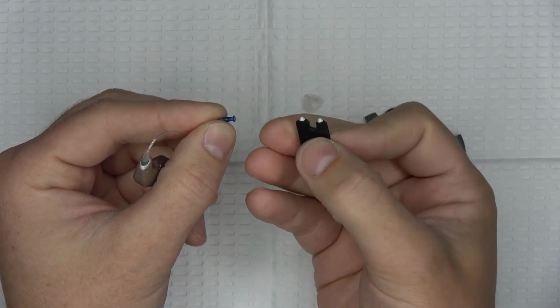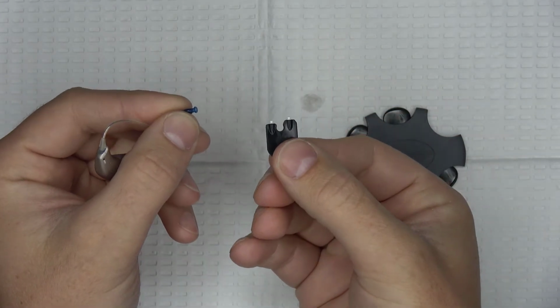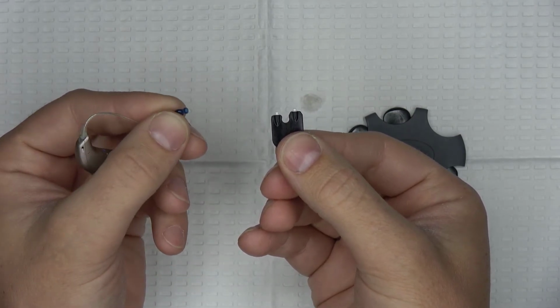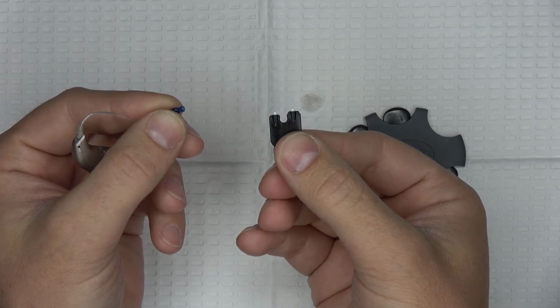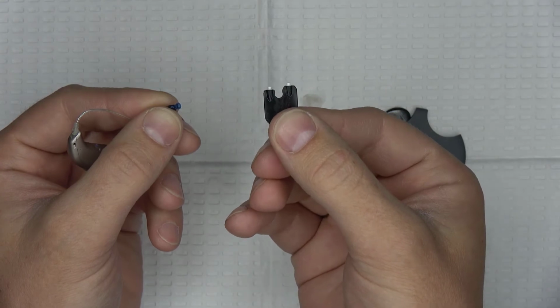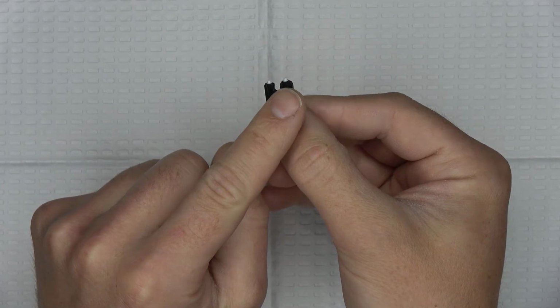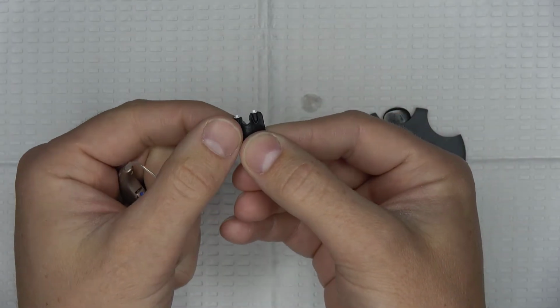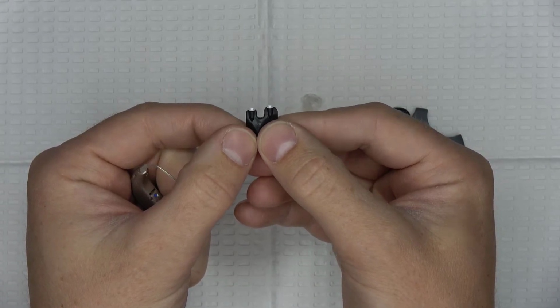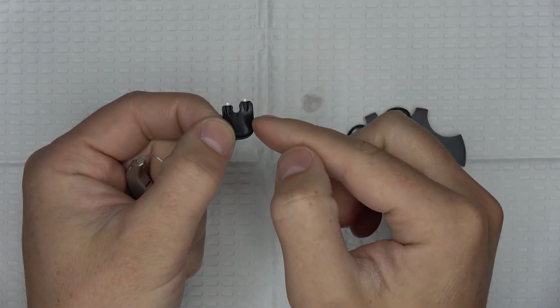Next, we want to install the new wax guard by repeating the same motion, but we need to make sure that we insert the new wax guard onto the receiver instead of trying to place the same old wax guard back onto the receiver. If you forget which tip is holding the new wax guard, either look to see which tip of the U is higher. The higher side of the U always holds the new wax guard. But if your close-up vision is not sharp enough to really tell the difference between the height of the U, then there's a slight bump on the pick that indicates the side that is holding the new wax guard.